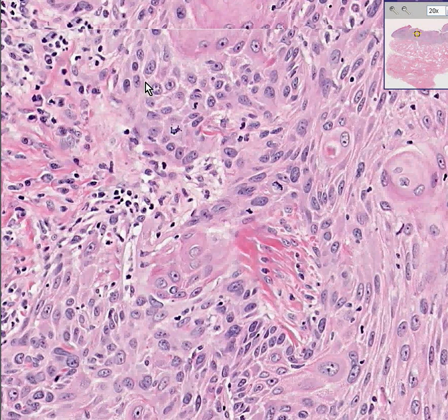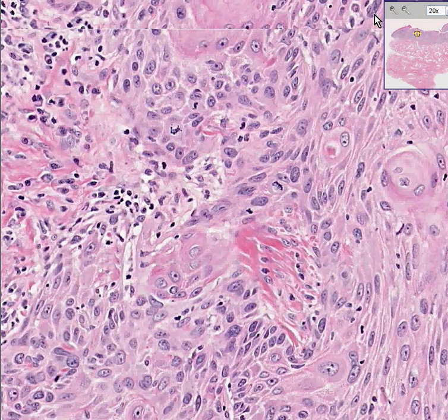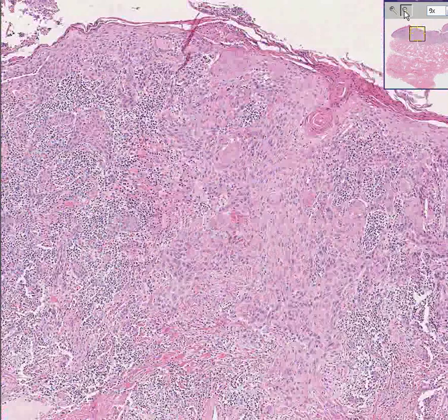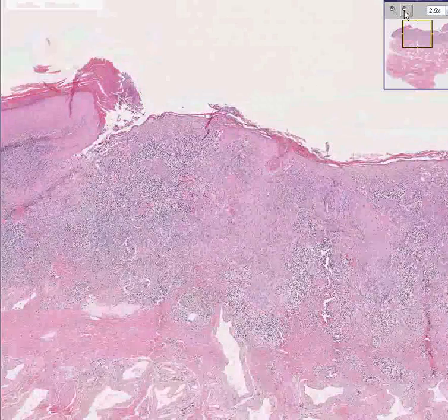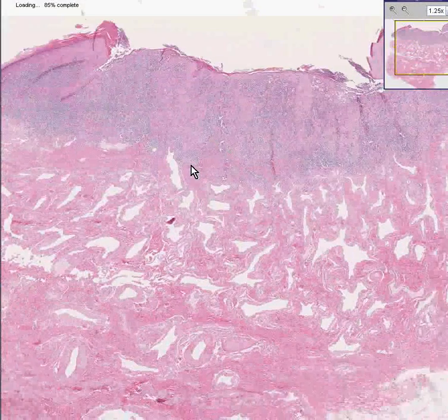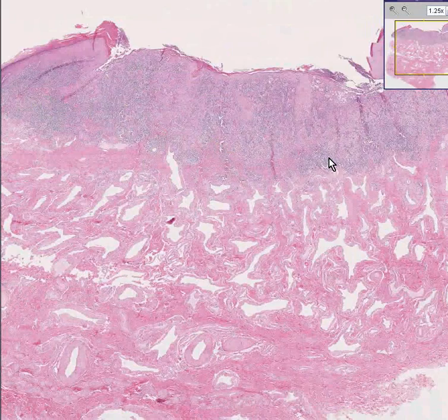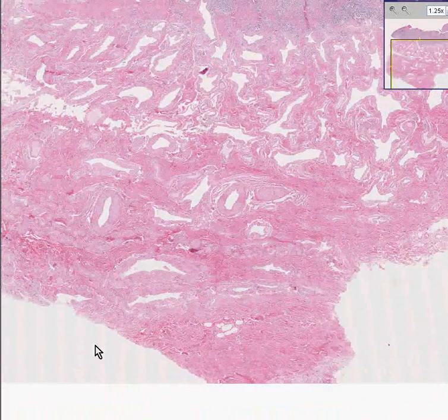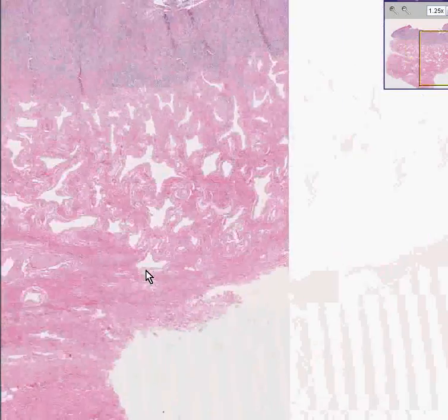Also notice all throughout here, very beautifully, are these intercellular bridges. Does this squamous cell carcinoma extend to the deepest part of the biopsy? No, it seems to generally stop along here, so you can tell the surgeon that the deep margins are clear.